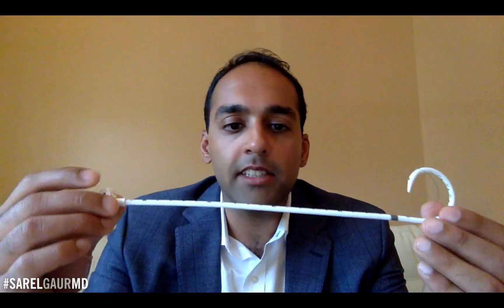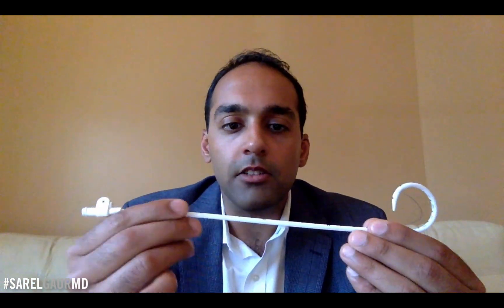This is another IR Basics lecture and today we're going to be talking about pigtail catheters. Here I have a pigtail catheter and we're just going to go through all the components of a pigtail catheter.